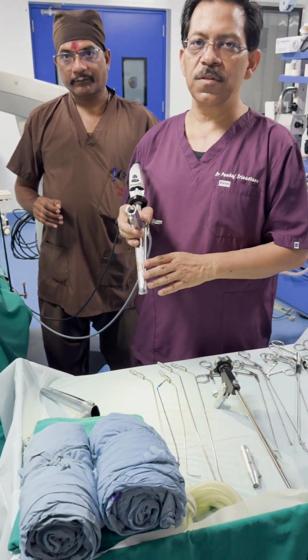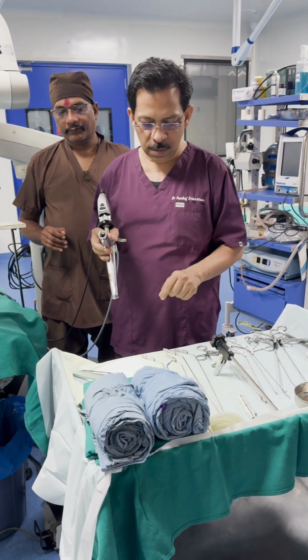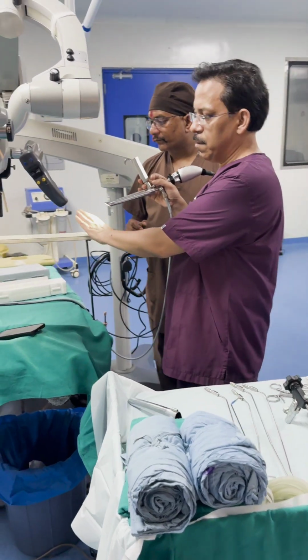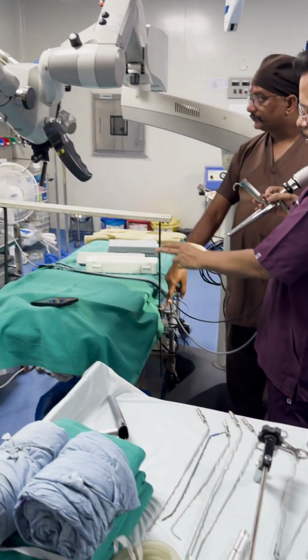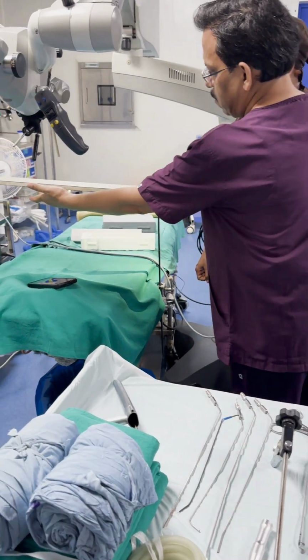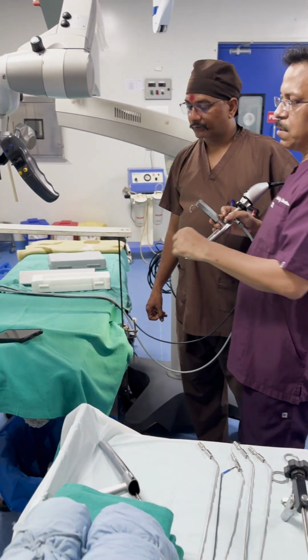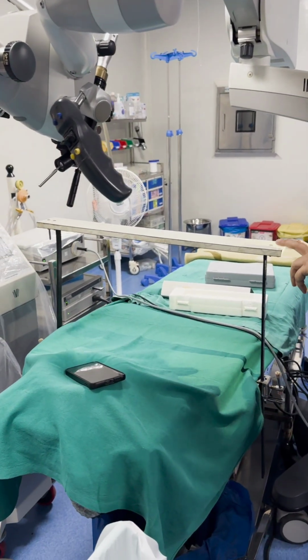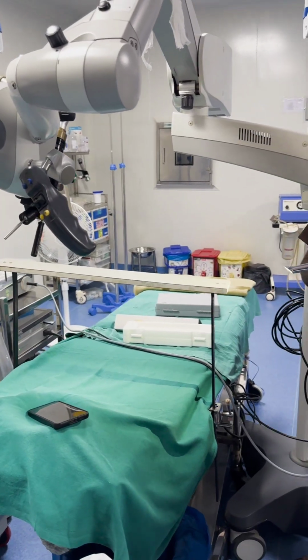But the limitation is we will have to use either cold instruments or radio frequency. Now this is the chest support which we have made ourselves. So this is a steel assembly, and this is a platform. The thing which is ready-made available in surgical shops does not have this platform, so there is sometimes a problem.